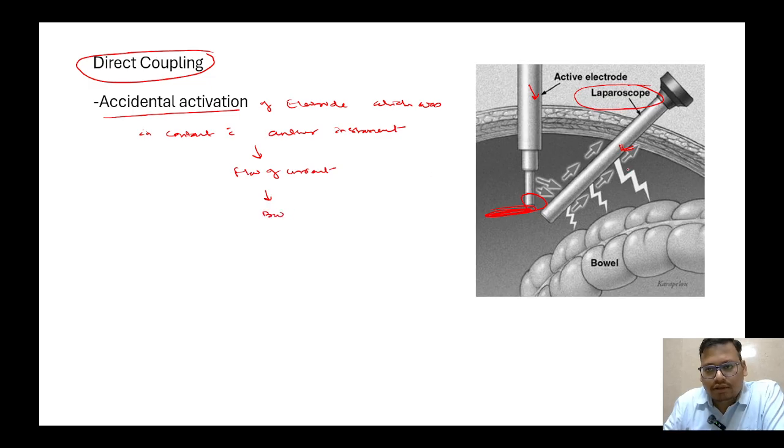Suppose the laparoscope or camera was in contact with the bowel or bladder or any other organ, so that will lead to distant site injury.